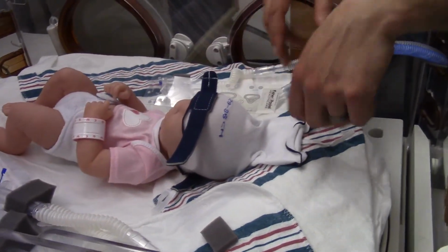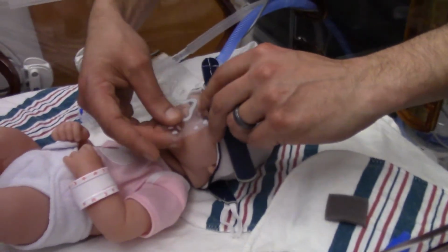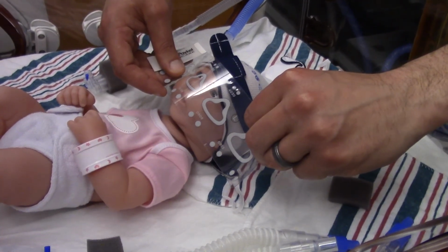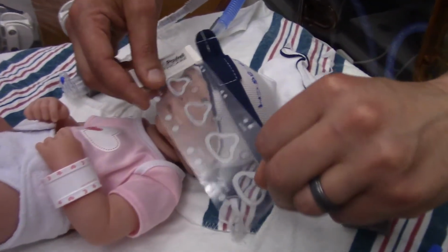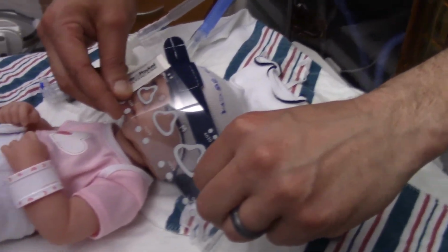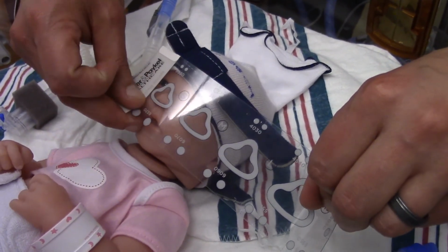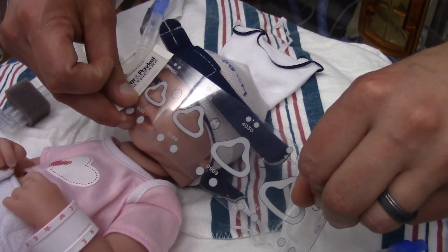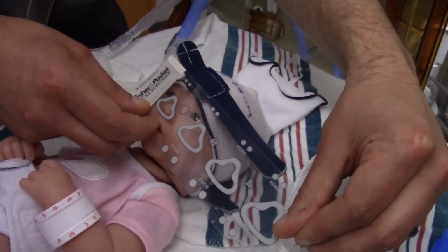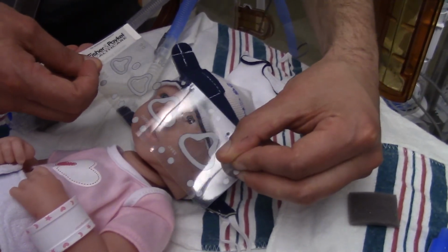A lot of times the RT is up here and they can't see if that mask is really covering the septum, or if it's really covering getting to the top of the nose, because standing at this position, it looks like I'm probably all right on the bridge of the nose, when really we already know that the small is too small. And from Connie's position, or the nursing position, they're able to call that out and say, no, you're going to have to upsize. Boom, there we go.